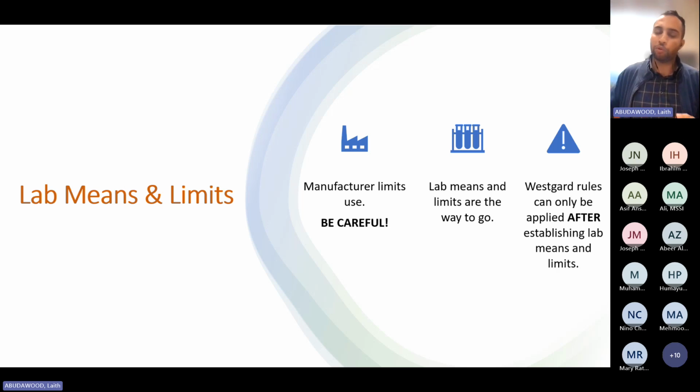There is a very critical point to understand. For QCs, there is no such thing as a target value. QCs simply give you ranges. Stago just tells you, from 12 to 16, if your analyzer measures within this range, that's it. You are okay, according to Stago. You are generally within the performance claims of Stago.